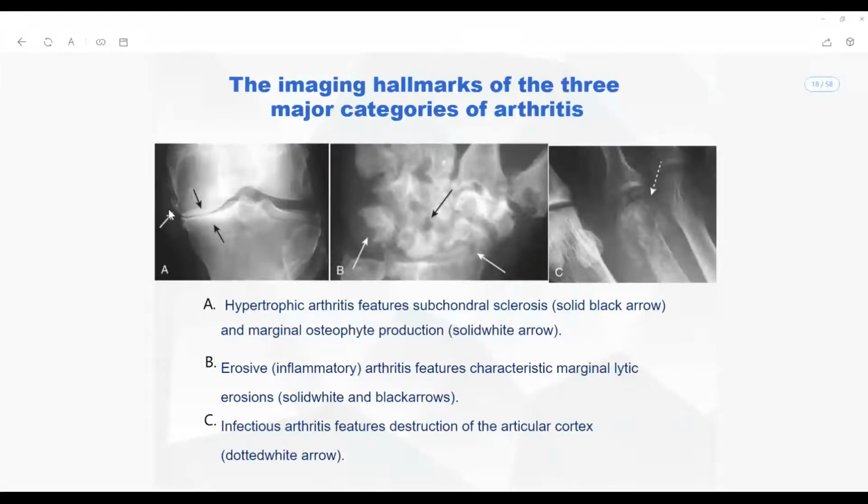Osteophytes are generally marginal. Most of the time they are marginal in location. Marginal in the sense they happen along the surface, and they happen either medially or laterally. Okay, completely outside the bone, and you can actually see them. There is extra bone growth. You can call them extra bones, which have nothing to do with the anatomical contour of the bone that is involved.